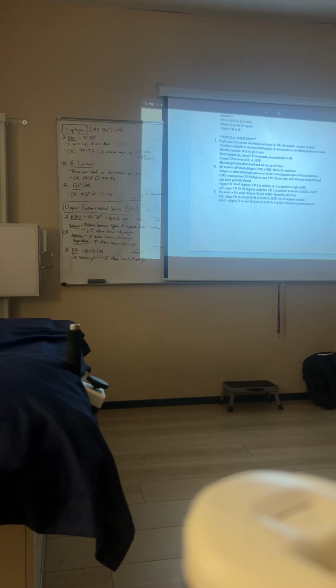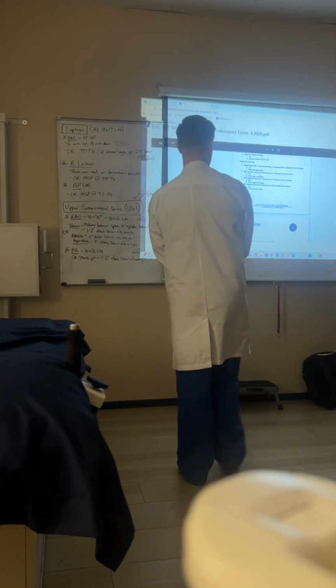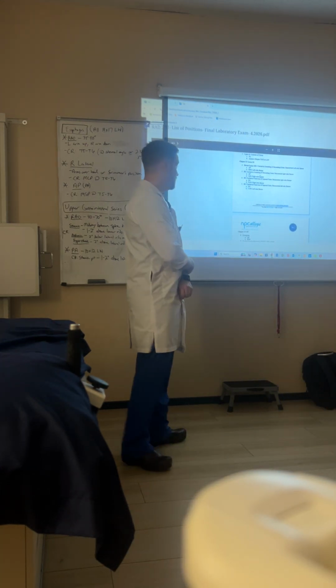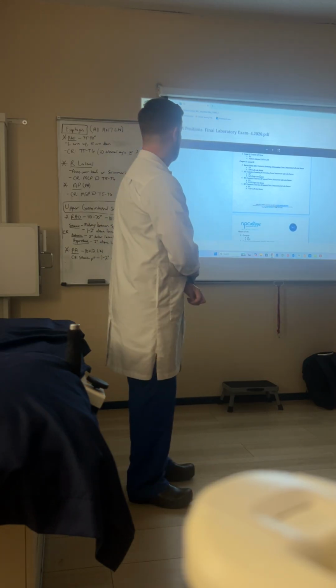They are the AP RPO. This is for showing contrast in the ascending and descending colon and demonstrating the left colic flexure, also known as the splenic flexure. Contrast in the ascending and descending colon and demonstrating the right colic flexure is AP and LPO.